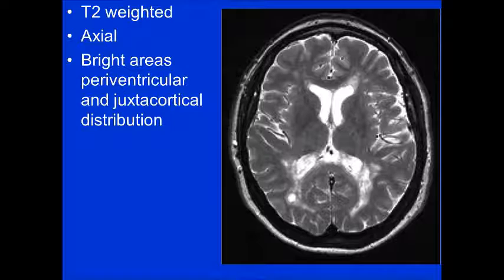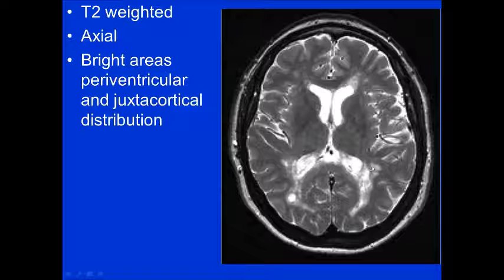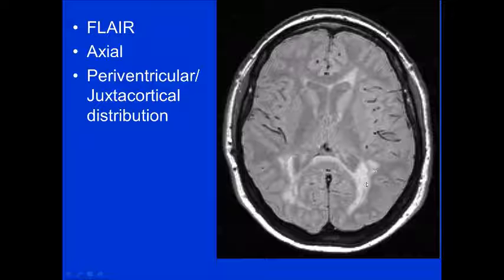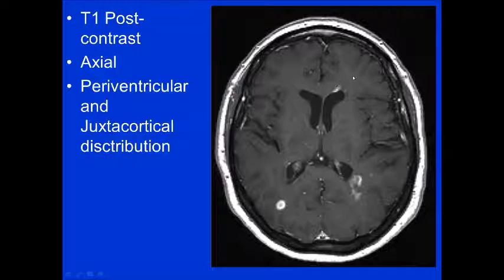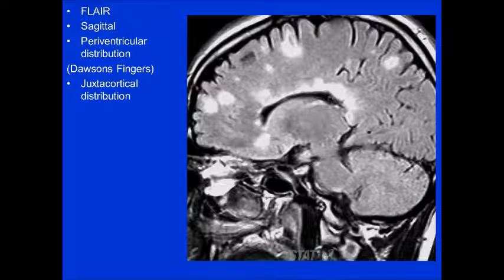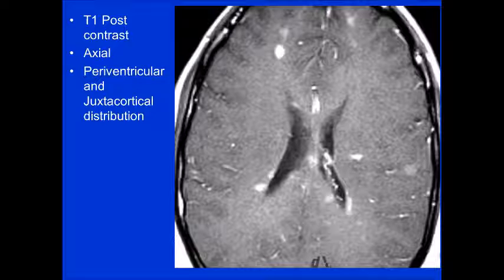On T2-weighted images you see bright areas periventricularly and juxtacortically, along the atria and the optic radiations. On the FLAIR, you see lesions periventricularly posteriorly and in juxtacortical frontal lobes. When contrast is given, the enhancing areas are periventricular and juxtacortical — these are the active areas of demyelination. On sagittal FLAIR, the periventricular distribution — Dawson's fingers — is classic for MS. Post-contrast images on different patients demonstrate enhancement in juxtacortical and periventricular locations.